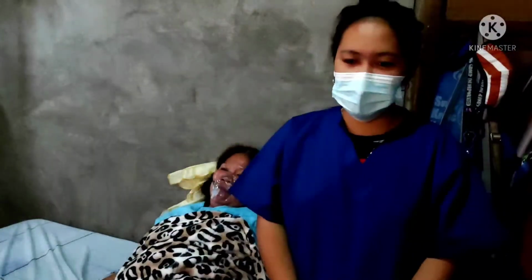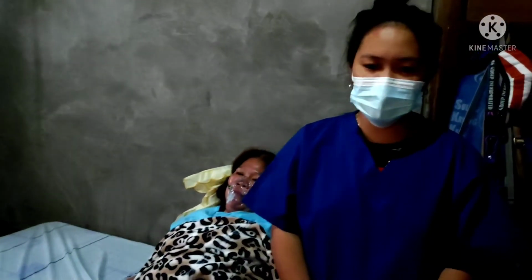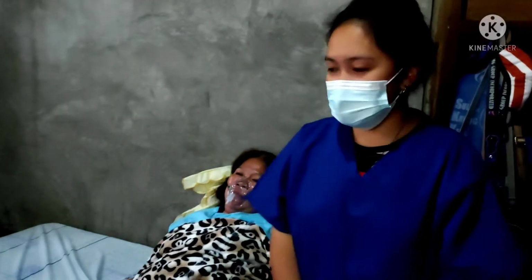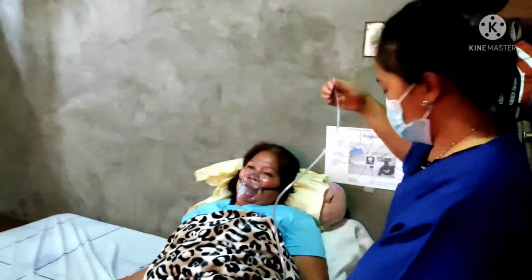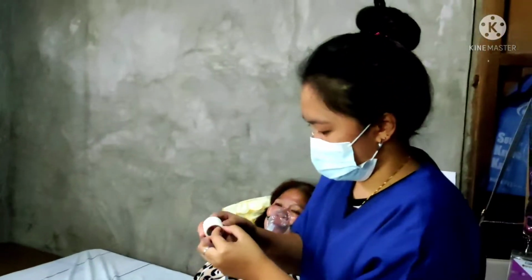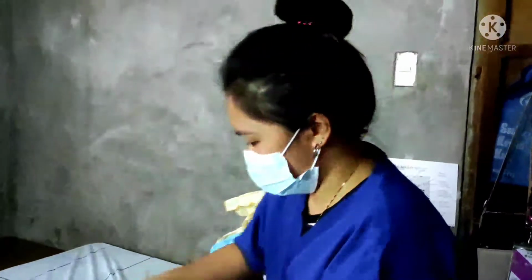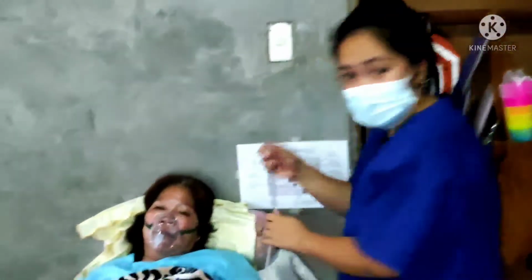Prepare your equipment by connecting one end of the tubing to the suction machine. So, this is our connecting tube. We put it here.